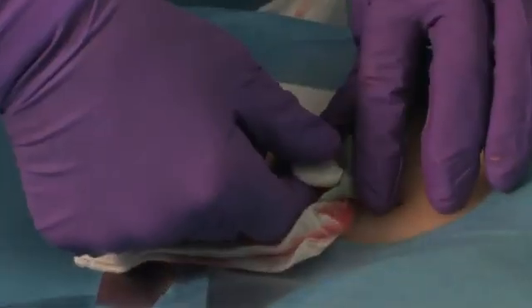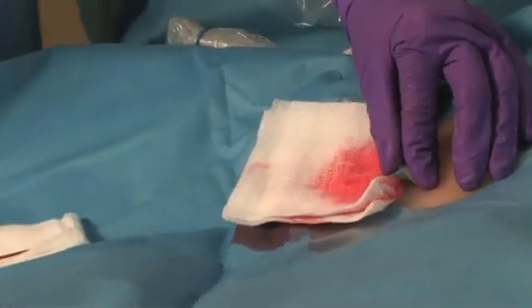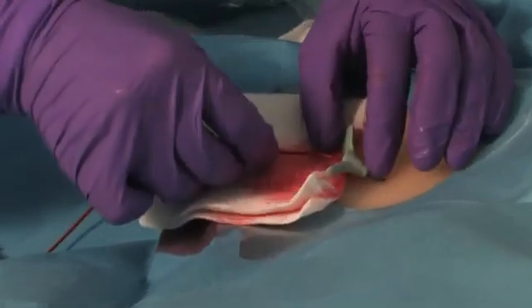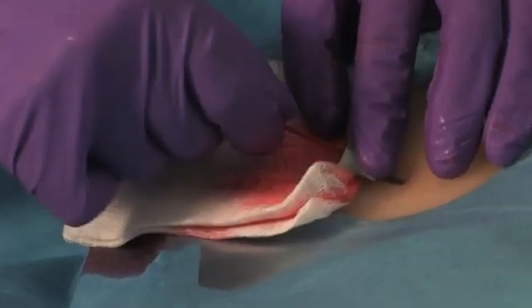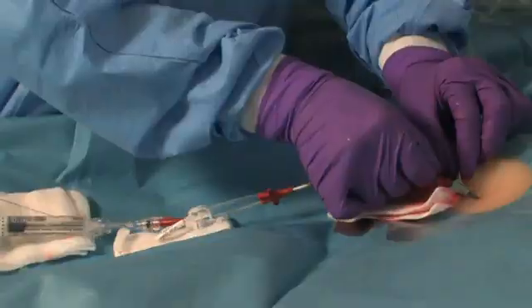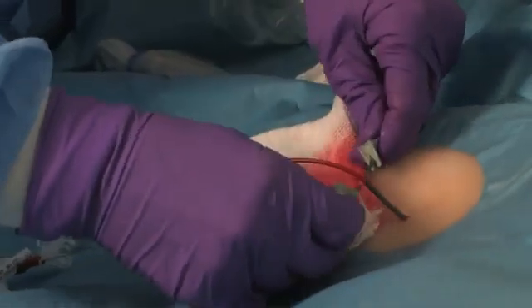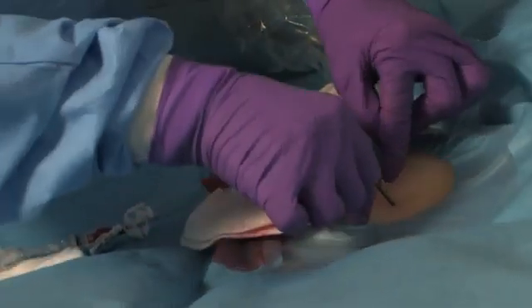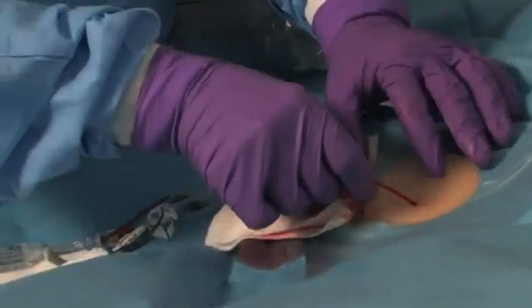She removes the wire and dilator, leaving the introducer in place. To prevent inadvertent air aspiration after removing the wire guide and dilator, she places a thumb or finger over the proximal end of the sheath. The clinician inserts the PICC with obturator into the introducer and slowly advances the entire measured length of the PICC into the vessel. The clinician instructs the patient to take deep, regular breaths; slowly advancing the catheter upon each inspiration helps draw the catheter into the superior vena cava and away from the jugular. Once fully inserted, she removes the peel-away introducer by grasping the two wings and pulling outward and apart, alternately advancing the catheter and pulling the sheath. A slight advancement of the catheter may be needed for final positioning.